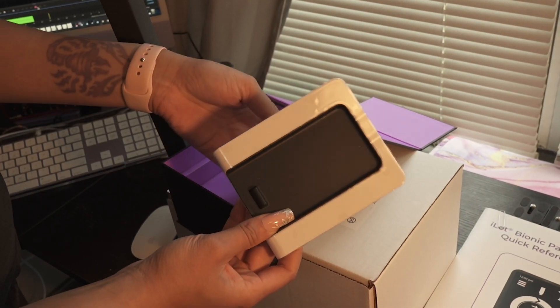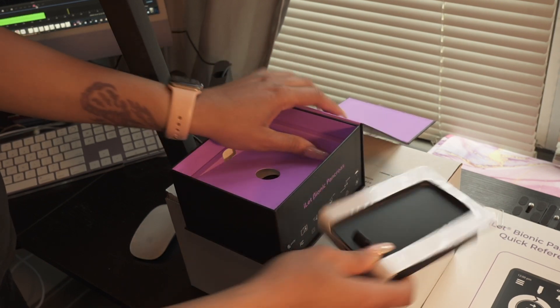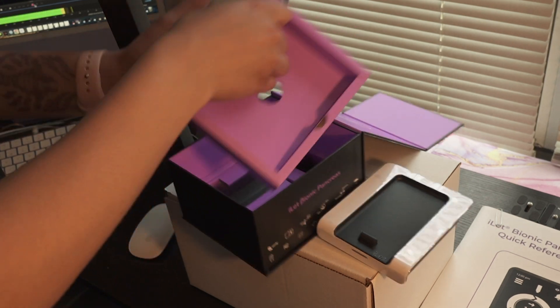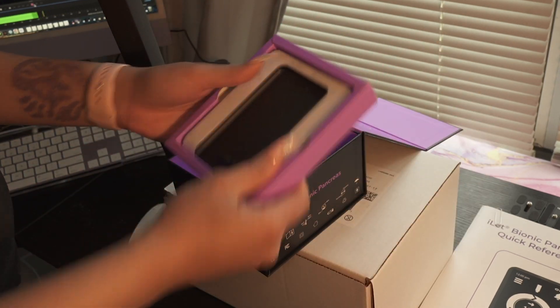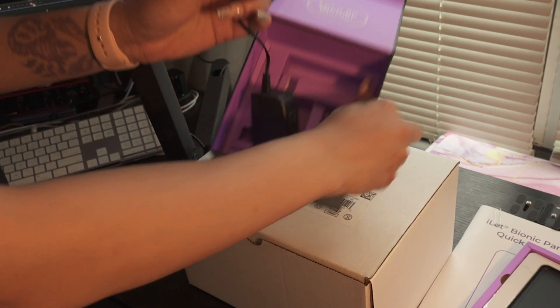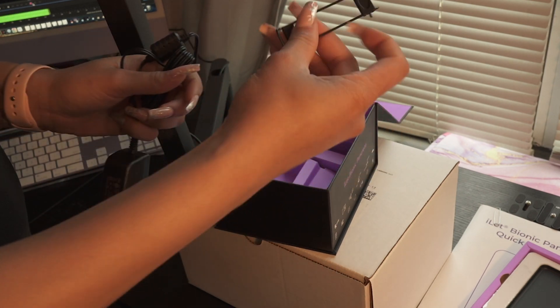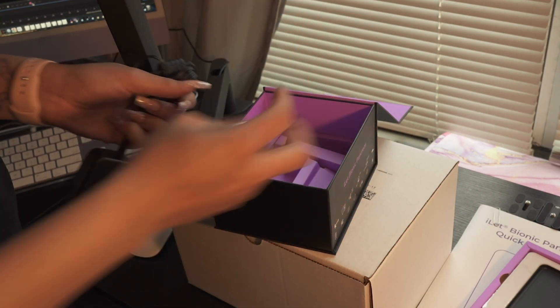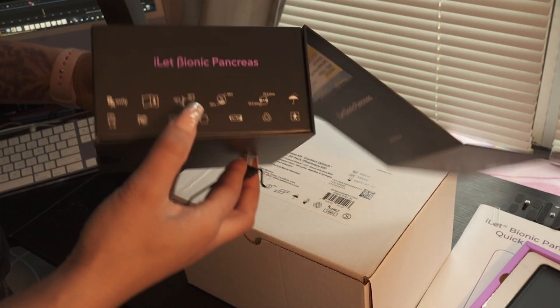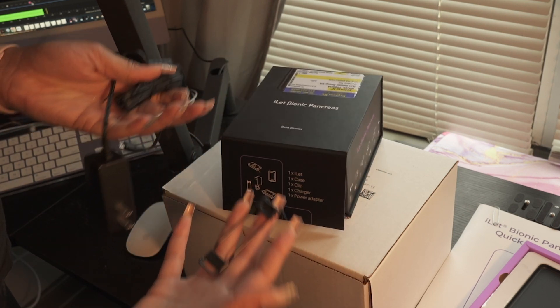There we go. We're going to place this to the side. We have the adapter cable and we have the clip. I think that's everything — let's recheck. One, two, three, four, five. Yes, these are the five items.